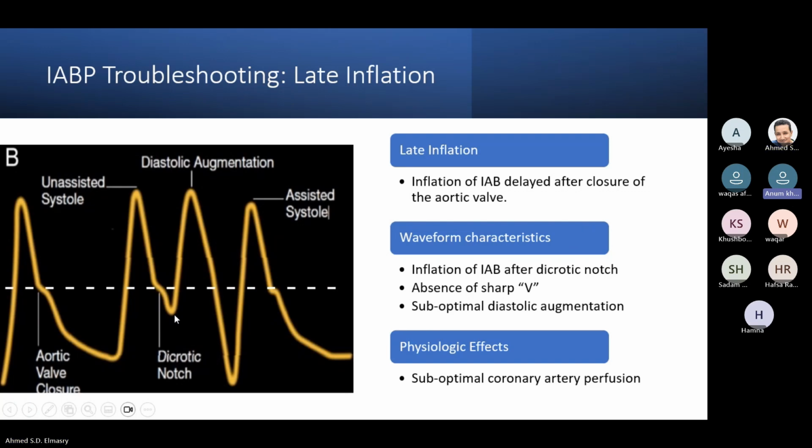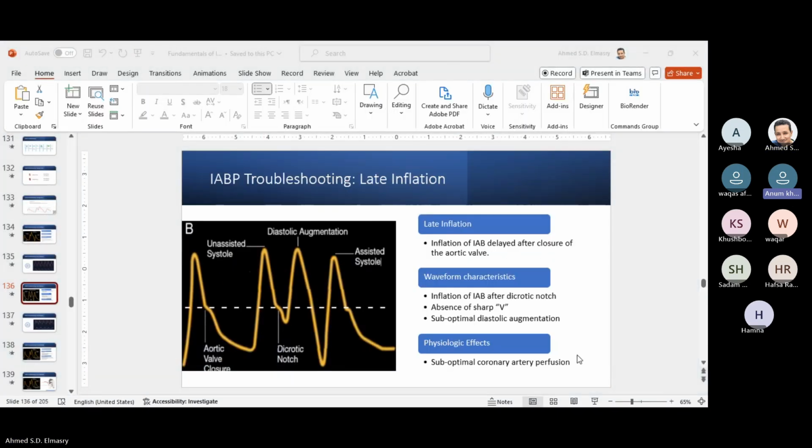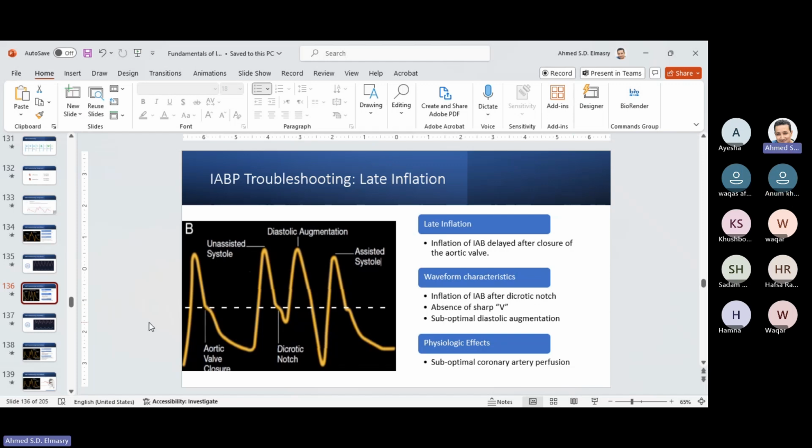And in this condition, the vessel will dilate further because the augmentation is decreasing, right? Yes. This condition of vasoplegia will increase the dilatation of the vessel further, and it will reduce the augmentation as well. The further dilatation is just because the augmentation is reduced.